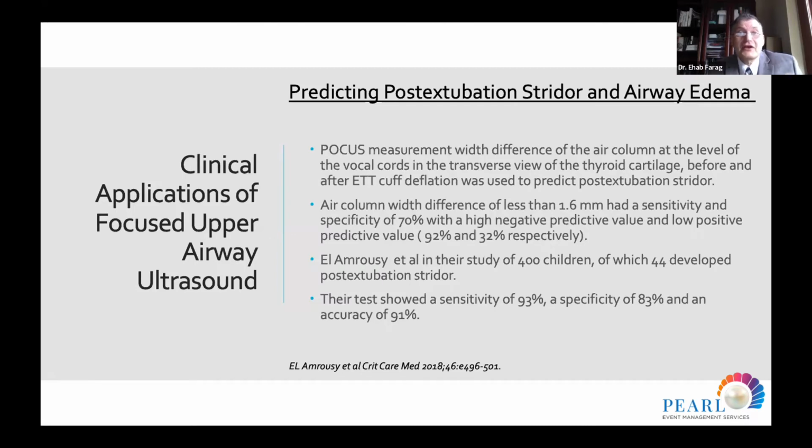of the endotracheal balloon or cuff. You have to understand that when the cuff is inflated, the airway column appears hyperechoic, or whitish, in the ultrasound. You can remember that when you're doing regional blocks and putting in catheters, and you would like to identify the catheters, you inject 1 to 2 cc's of air, and the tip of the catheter is identified as whitish or hyperechoic, because air is hyperechoic.